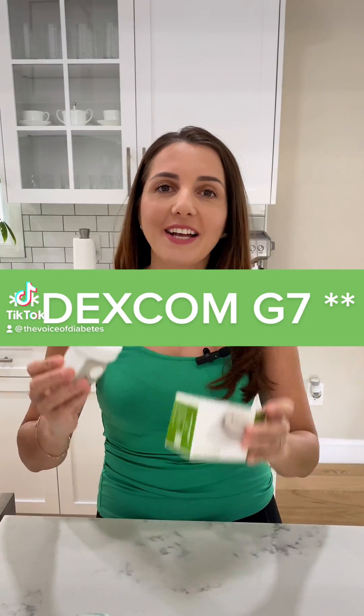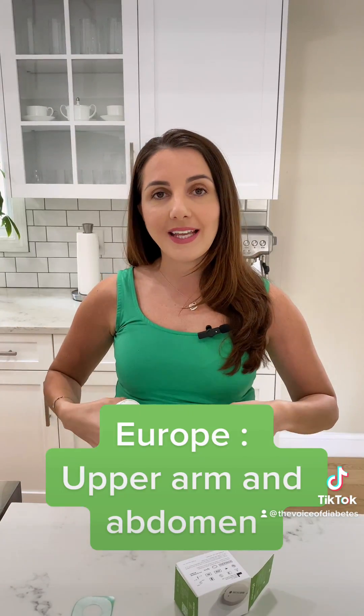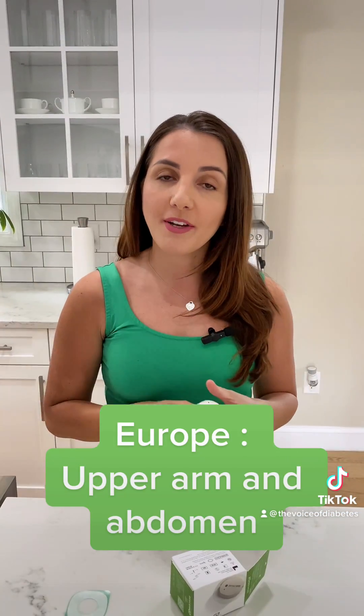The Dexcom G7 is finally available in the United States and it is now approved to wear in the upper arm. In the United States it is no longer approved for the abdomen, but if you are in Europe you can wear it both in the abdomen and the upper arm. In the United States it is only approved for the upper arm for ages 7 and above.